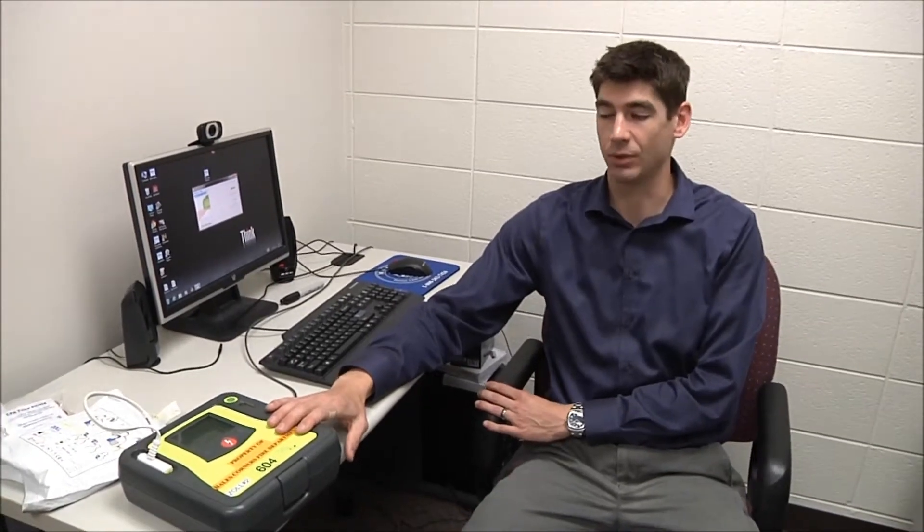Hi, I'm Eric with Milwaukee County EMS Communication Center. Today I'm going to show you how to upload data, CPR data and ECG data from your AED Pro to your computer.